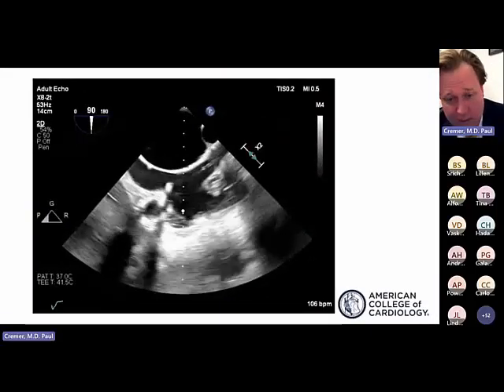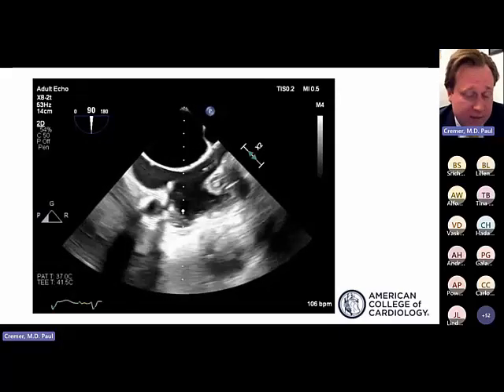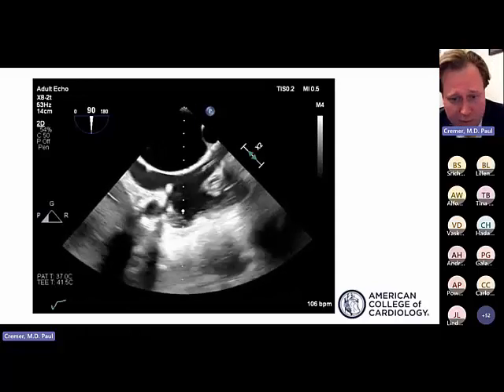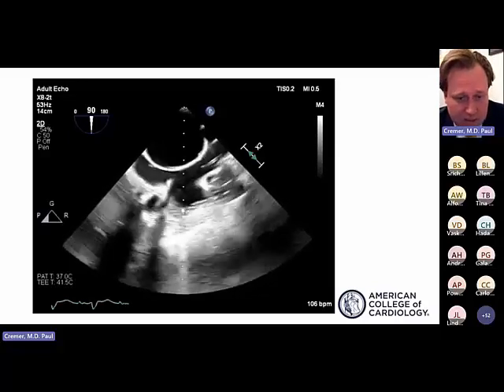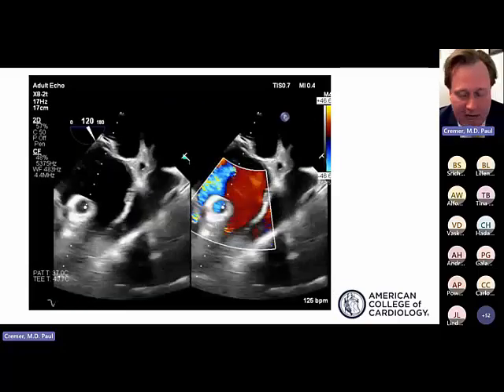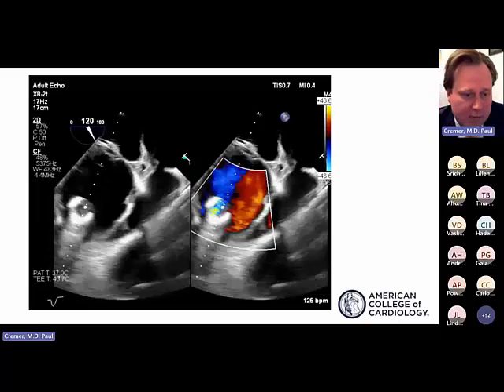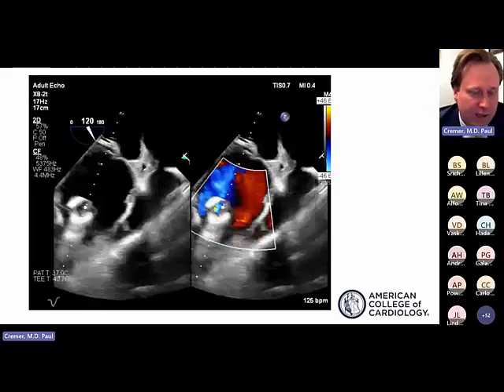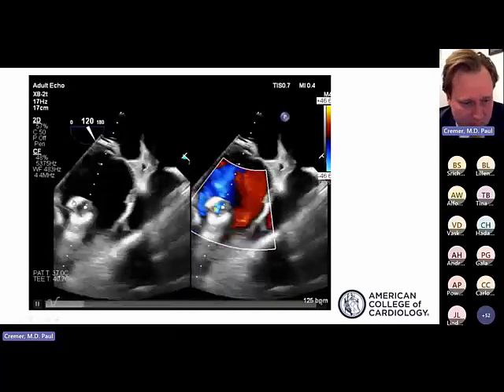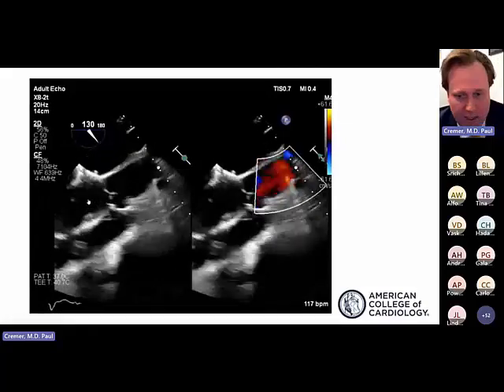When you're doing these transesophageal echoes, it's important to interrogate assiduously all of the foreign material. Here's a representative bicaval view where we're looking at her cardiac device lead, which looked okay on echo, as well as a central venous catheter. Of course, this patient has an LVAD. This is the inflow cannula in the LV, and you can see the flow looks fairly laminar, and there are no independently mobile echo densities associated with it.